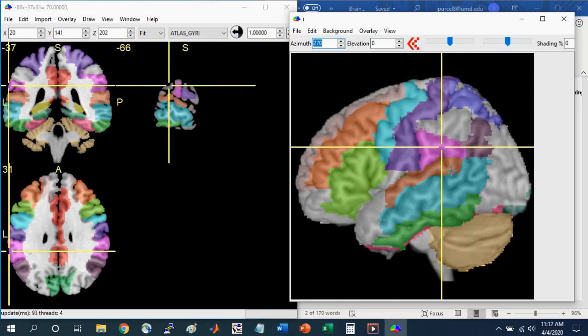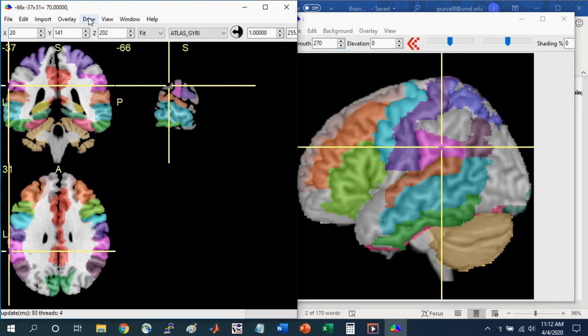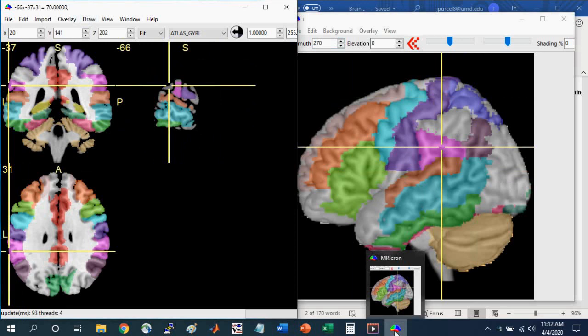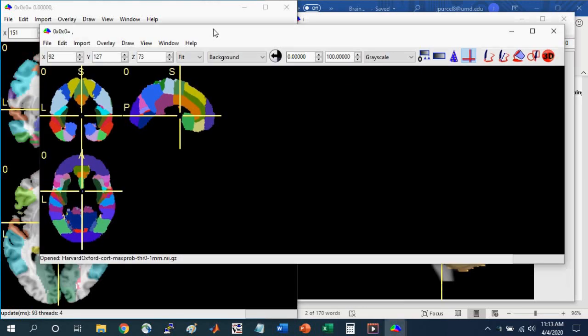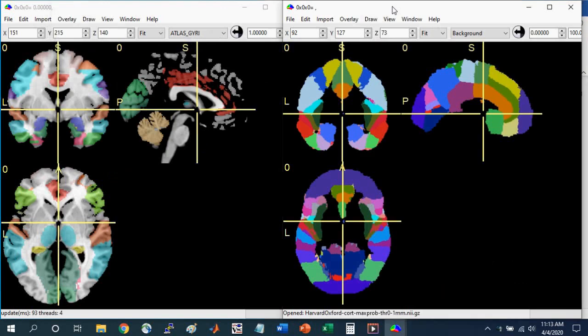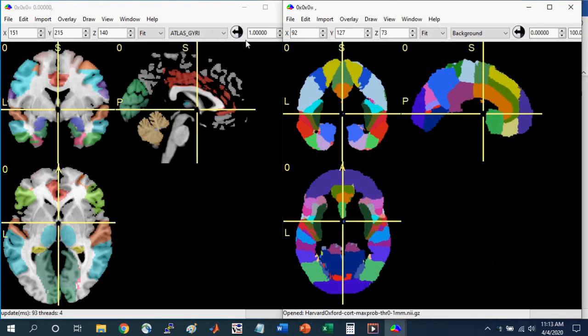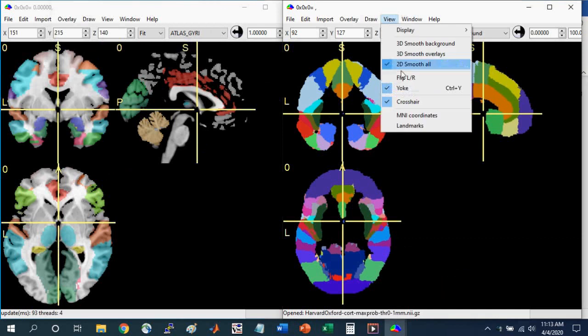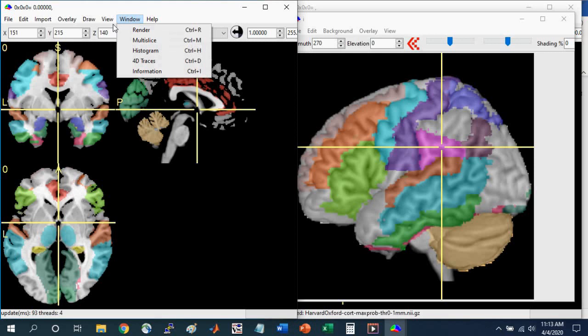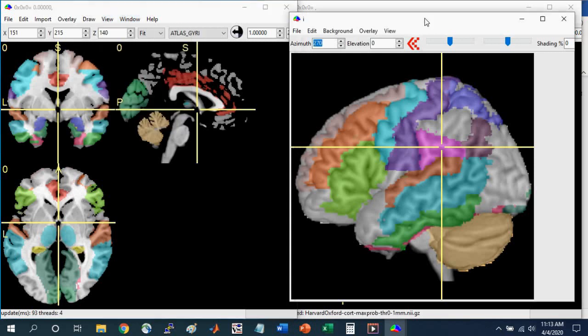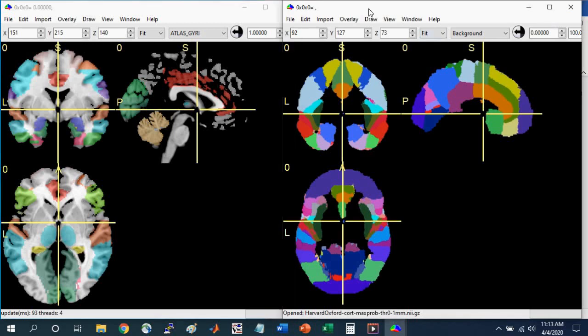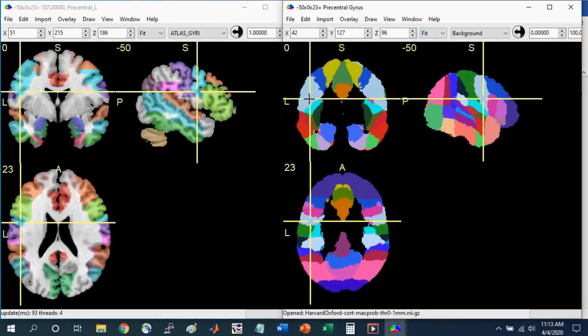Using the rendered tool allows you to navigate to the surface of the brain and identify these structures in their slice view and see how they relate to each other. Next I want to show you a very useful feature of MRI-Cron. If I go down to the MRI-Cron icon and right-click, I can open a new MRI-Cron window. I can also yoke these two windows together. So I can go to view, yoke, and make sure that this is checked in both windows. If I left-click in one window, it'll jump to that specific coordinate in the other one. You can open as many MRI-Cron windows as you want. This is a very useful way to navigate the brain and learn neuroanatomy.